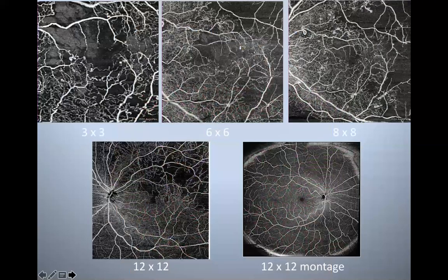Here are some examples of 3x3, 6x6, 8x8, 12x12, and a 12x12 montage on the bottom right. In the 3x3, this is the same patient on these scans, not the 12x12 montage, but the others are all the same patient. On the 3x3, I can see these aneurysmal changes, and I can still see them on the 6x6, but they kind of go away on the 8x8, and they're really gone on the 12x12. I can also see these gray patches in here.